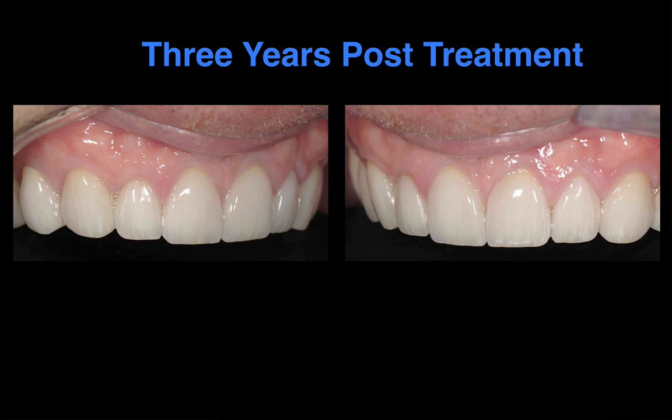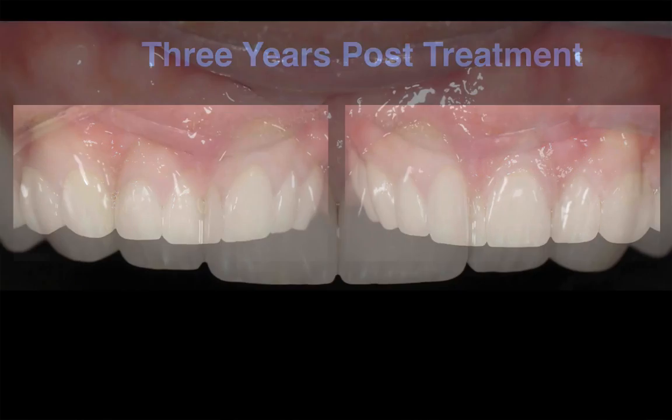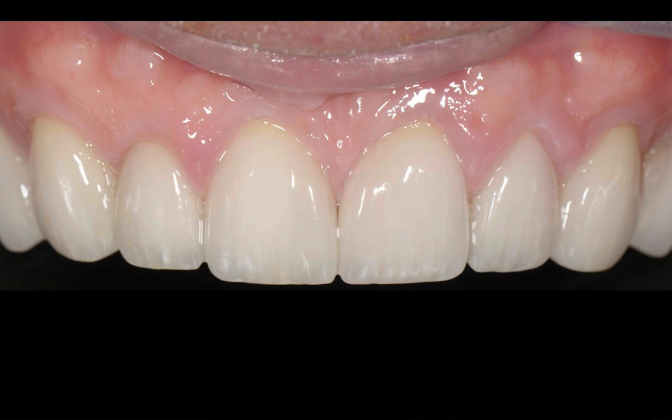So just some more views. Natural looking aesthetics. These are zirconia restorations, but layered in such a way that they can look very natural. And the final view. And I'll just end by saying that you can do this kind of dentistry. You know, I have an everyday practice. I just really document well, and I work with a great ceramist. So I'm fortunate that way, obviously. But you can do this kind of dentistry. Beautiful dentistry with precise fit and occlusion is not just for the gurus.